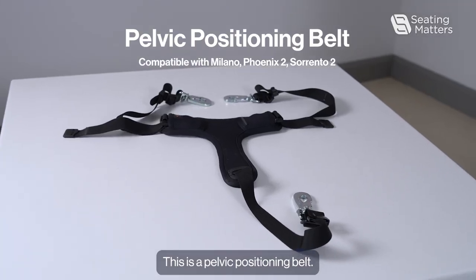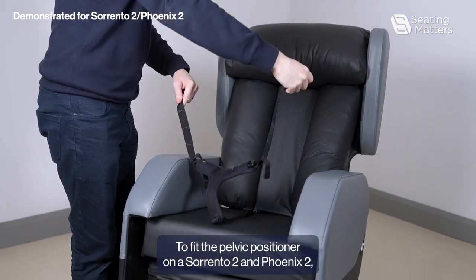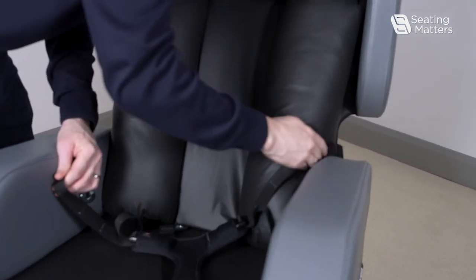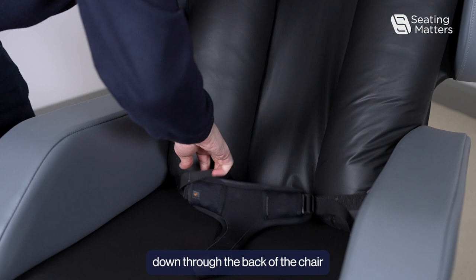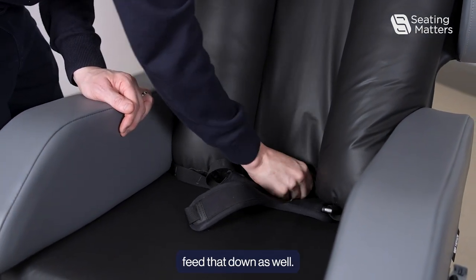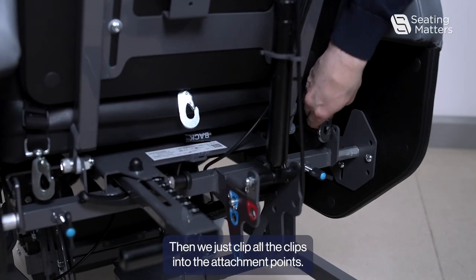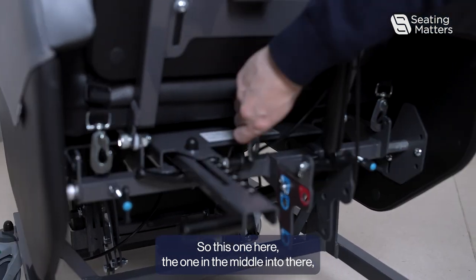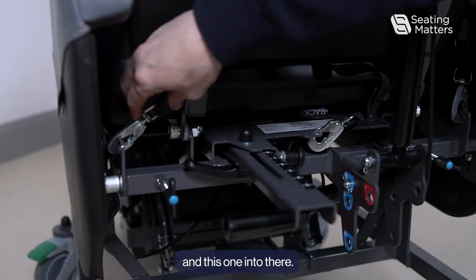This is a pelvic positioning belt. To fit the pelvic positioner on a Sorrento 2 and Phoenix 2, you need to feed the straps on the outside down through the back of the chair, and the strap in the middle, feed that down as well. Then we just clip all the clips into the attachment points — this one here, the one in the middle into there, and this one into there.